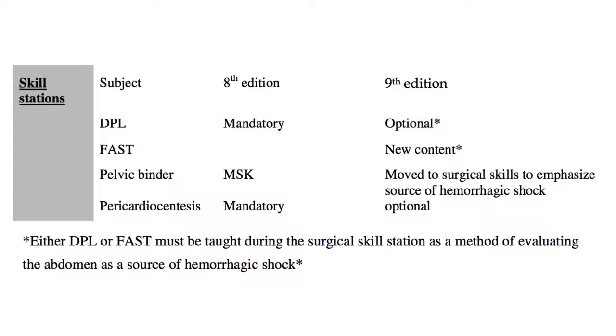Welcome. We're going to have a short video discussing the EFAST. Now, the FAST has been known as the Focus Assessment with Sonography and Trauma. The EFAST adds the word extended, so it's the Extended Focus Assessment with Sonography and Trauma. This is one of the earliest EM focus applications for point-of-care ultrasound. Over time, the use has been expanded throughout penetrance into emergency medicine and other areas.